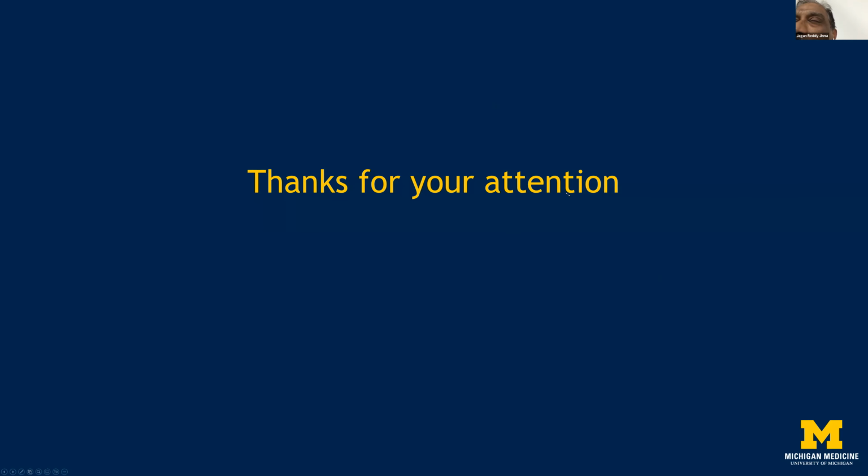My basic question is, these pediatric children we will be doing under anesthesia, so whatever study we are doing, we should be extremely careful. So I just want to know the protocol, whether we can do CT at the same time, whether contrast is to be given and MR spectroscopy to be done. And if not, which cases should be selected for contrast and spectroscopy, and which should not?